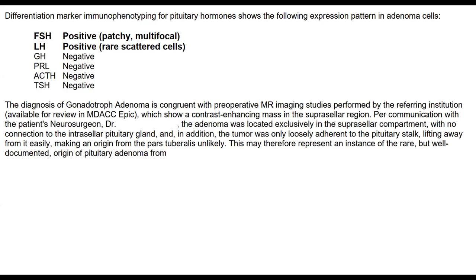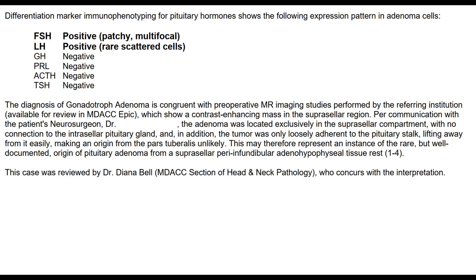This may therefore represent an instance of the rare but well-documented origin of a pituitary adenoma from what? There's no connection to the stalk or the pituitary. From a suprasellar peri-infundibular adenohypophyseal tissue rest. Did you even know they existed? If you didn't, now you do. Phenomenally rare, but well recognized. And guess what? We just had one for real, live, at MD Anderson Cancer Center. You like that? And there's a reference.